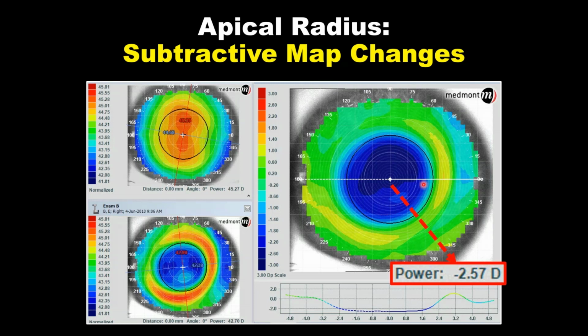And in this case, we've done orthokeratology. We notice all the flattening within the pupil, very much centered to the black pupil margin. So I think we've done a good job of orthokeratology in terms of where the epithelium is flattening. The second thing is related to apical radius.